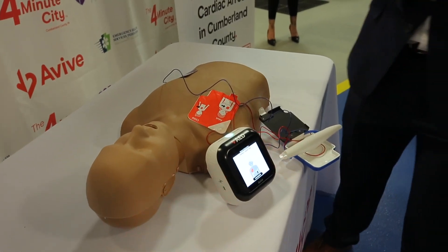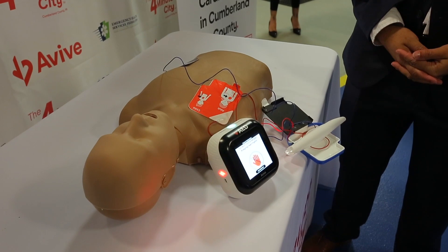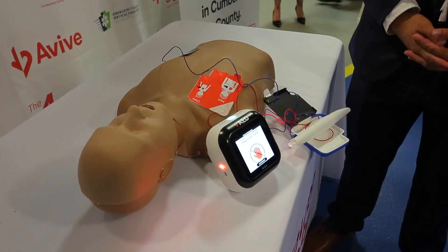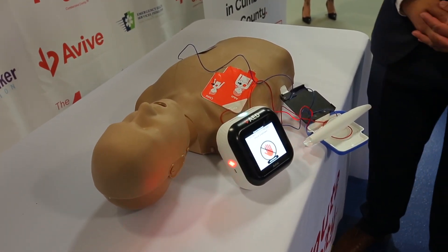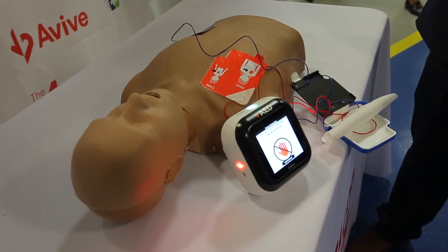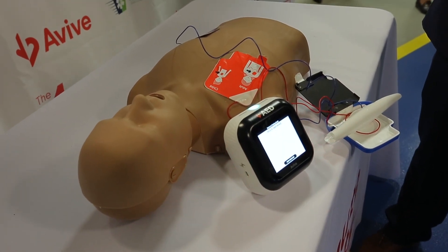Patient detected. Do not touch the patient or pads. Analyzing heart rhythm. Shock is advised. Move away from the patient now. Stand back. Delivering shock in three, two, one. Shock delivered.